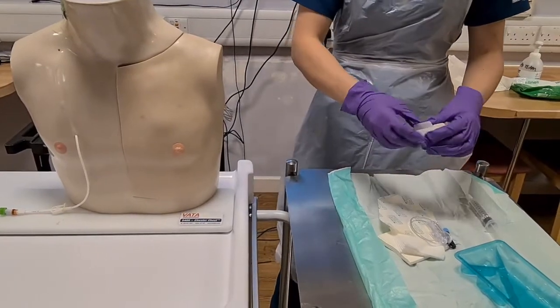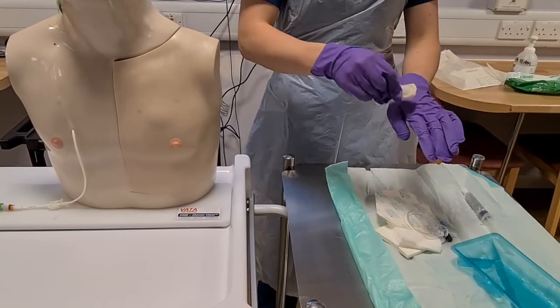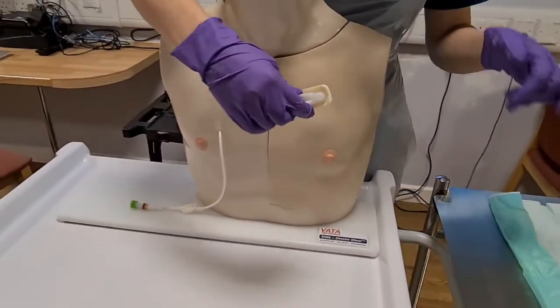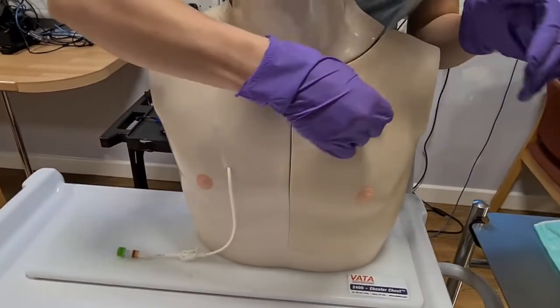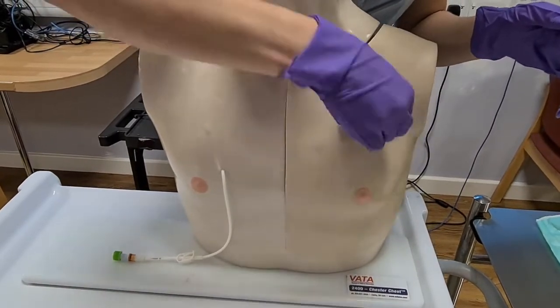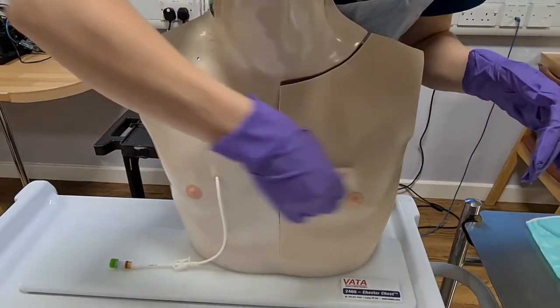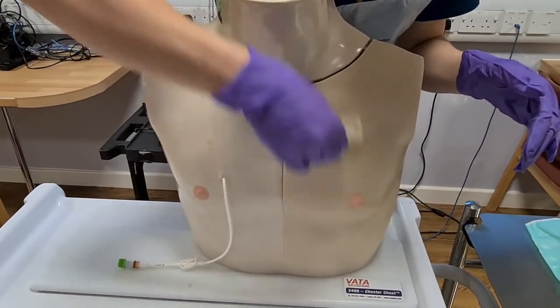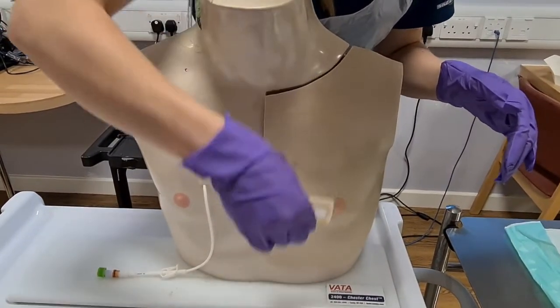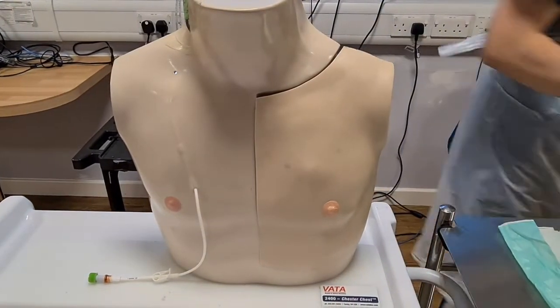First off, clean the patient's skin, so I'm going to squeeze it together, making sure the chlorhexidine goes all the way through. Press it on your glove, yeah, lovely. And then clean a really, really big area, for about 30 seconds. That's it, throw that away.